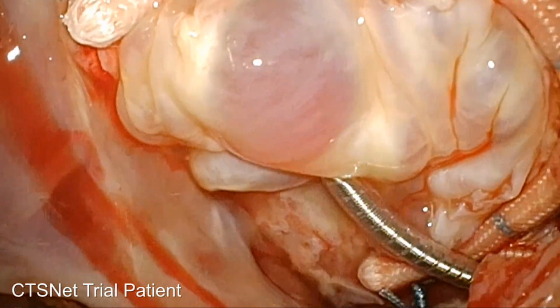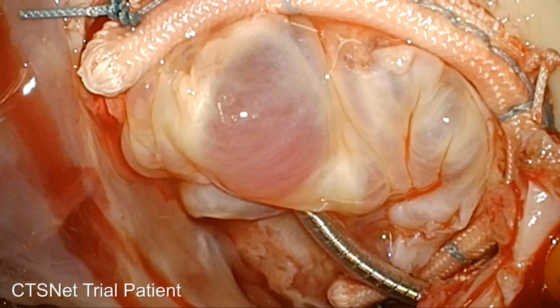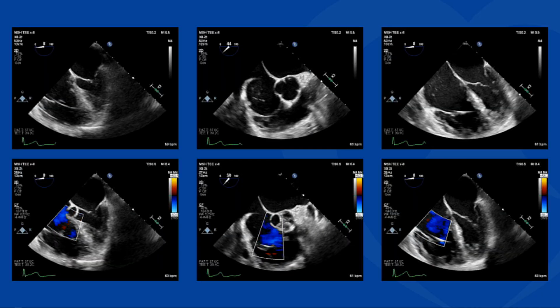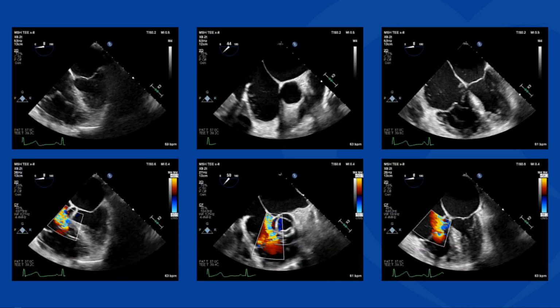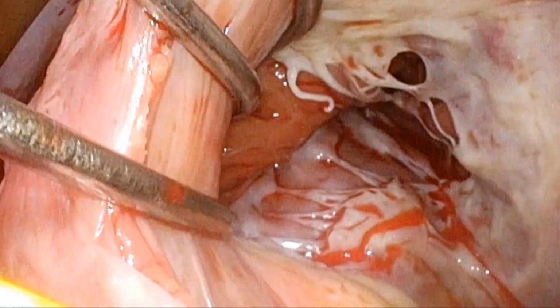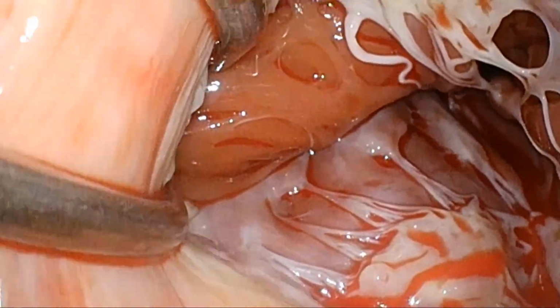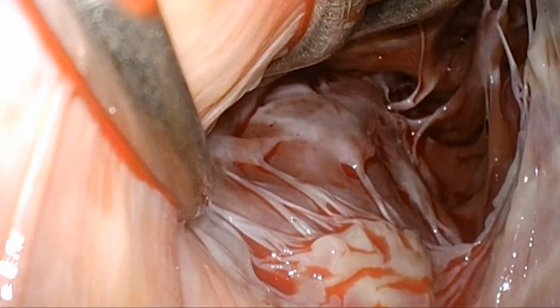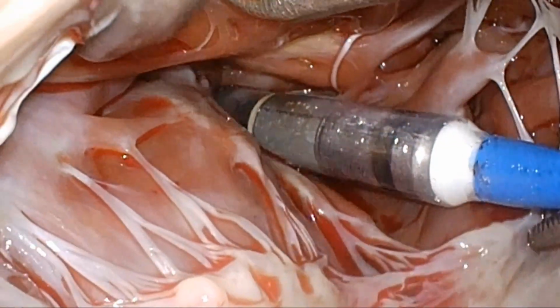There are many ways to manage the leads. You can put it in a commissure, or you can exclude it, or you can take out the leads and use epicardial pacing or transvenous pacing, or a leadless pacemaker. This is another patient who had status post renal transplant. The patient presented with severe primary TR. Look at the tricuspid valve, restricted valve, torrential TR, eccentric jet. So for isolated tricuspid, sometimes you can do it on a beating heart or arrested heart, depending on the RV function and the comfort of the surgeon and things like that.